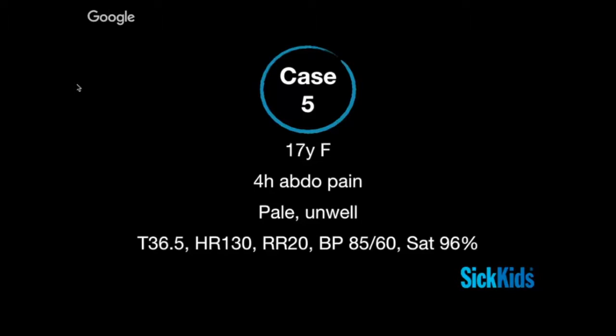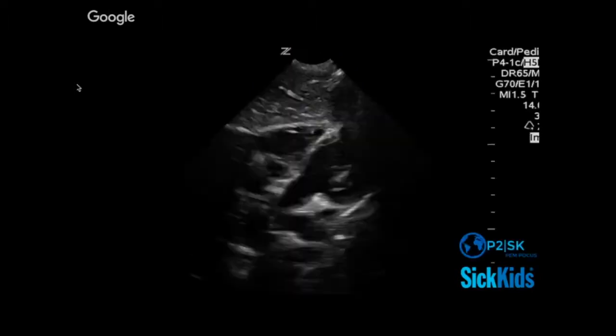Yeah, you're fast for intra-abdominal hemorrhage. Why? Yeah, ruptured ectopic. Beautiful. Okay, so let's start in our sort of, and I'm not saying you have to apply this routine the way that I'm applying things. I'm often showing you a subxiphoid first, and then a parasternal long, and I'm doing everything with the low frequency probe before we switch to the high frequency probe. You can do things in whatever order you guys think makes the most sense.